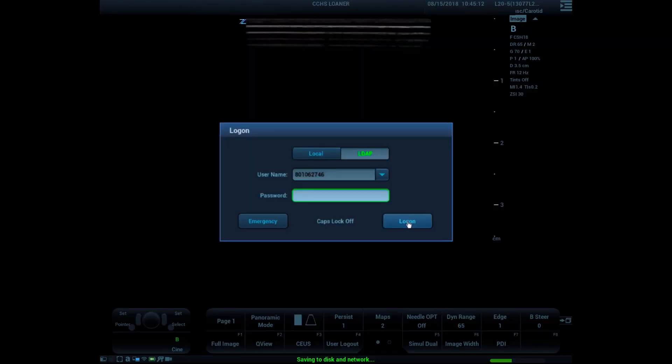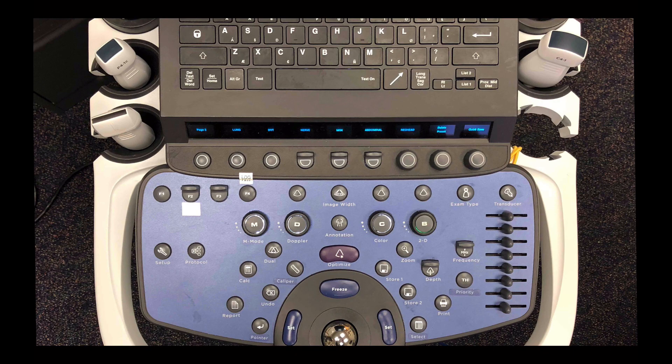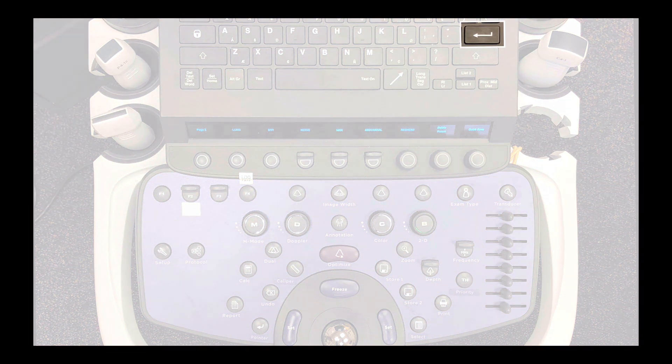You can see that your ID number has been placed in the login dialog box after barcode scanning. Type in your system password — this is the same one you use to log into other systems. When your system password is updated, it will be updated for the ultrasound systems. The ultrasound system will have to be connected to the network to allow the login. After typing in your password, press the return key. You could also use the trackball and set keys to click on the dialog box. Once logged in, you will see the imaging screen and can start to image.